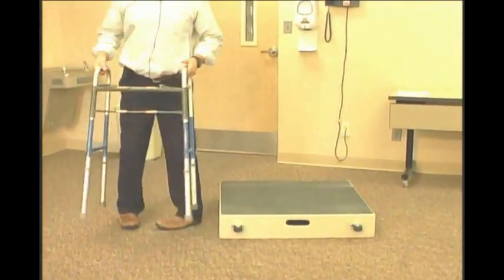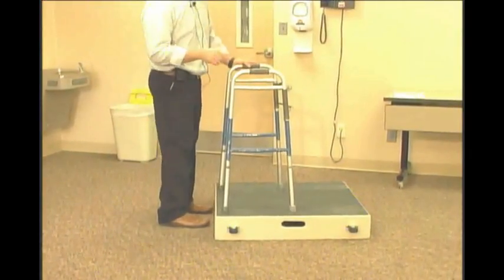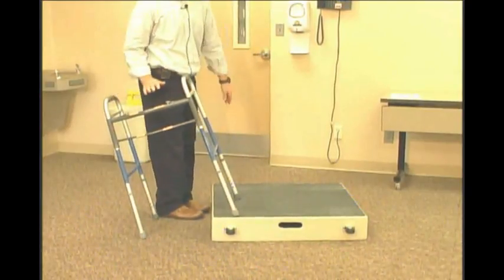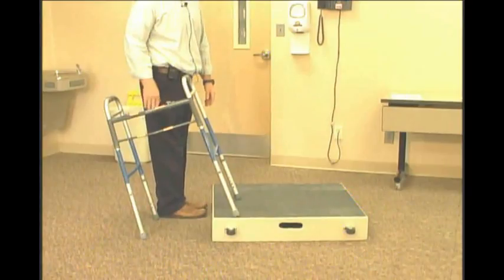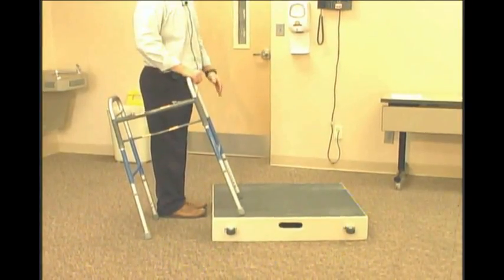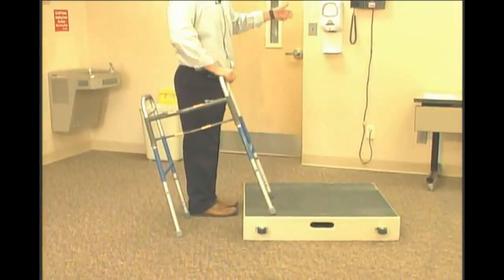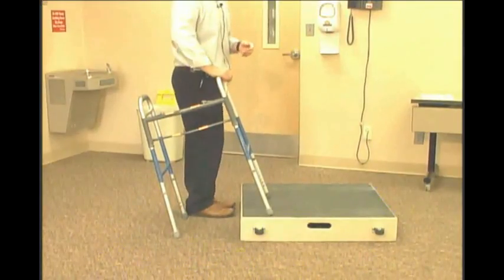So let's say you don't have a step that can fit the walker on it completely. So what we like to do then is we utilize the walker at an angle. So what I mean by that, we put the walker at my side, so it's on the step that I'm on or on the floor, on the step that I'm going to. The sequencing of the legs is the same. So as you can see, this is why it would be nice to have a rail to hold on to, or otherwise we'll educate you on how to use your care partner to get up and down these steps.